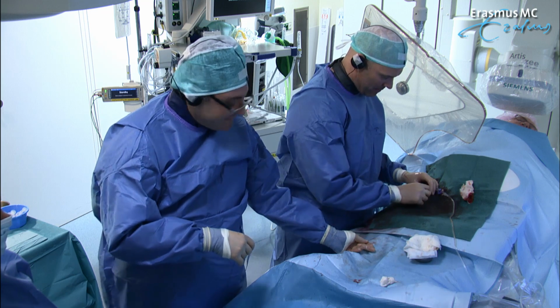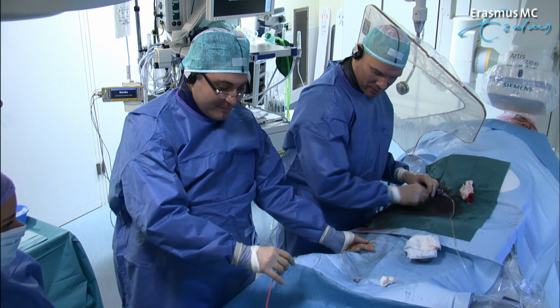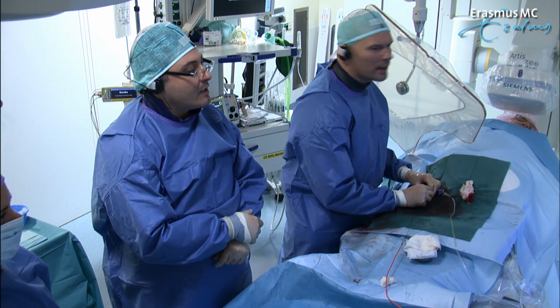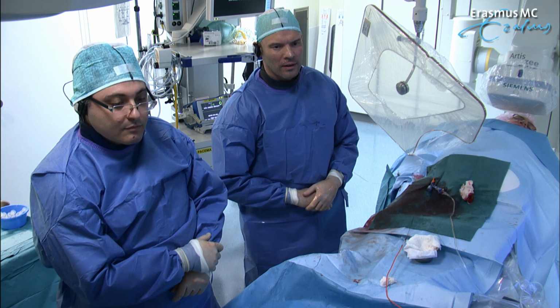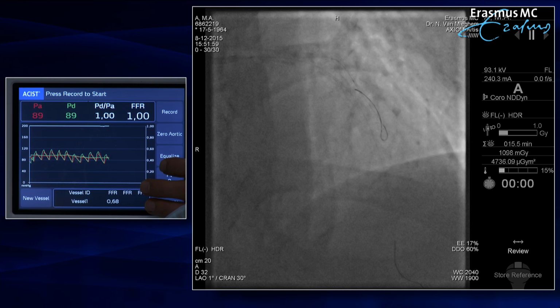Okay, so in we go. And then... Okay, so let's see if we still have a 1.0. Let's have a look at our result.